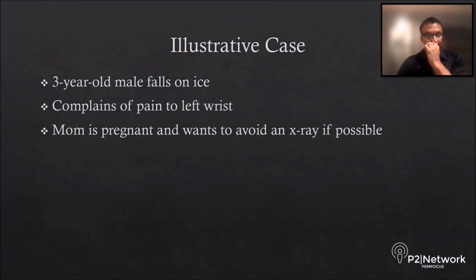So let's look at a case. This is a 3-year-old male. He fell on the ice and is complaining of pain to his left wrist. Mom is pregnant and wants to avoid an x-ray if possible. I can't say that I blame her.